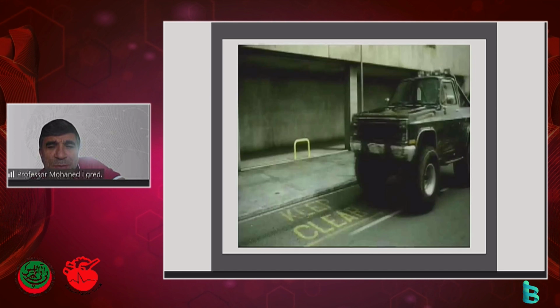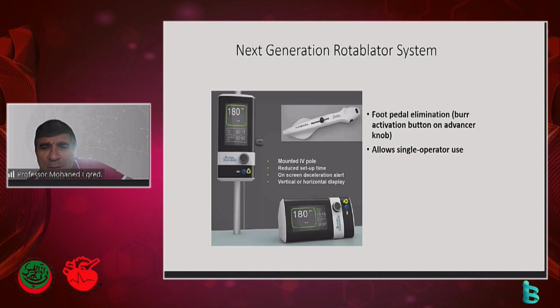So I think you've seen all this Rotapro, and I understand that it is available also in Pakistan right now. It's being done, which is excellent. It has taken the foot pedal away, so it's all controlled with the hand on the table.